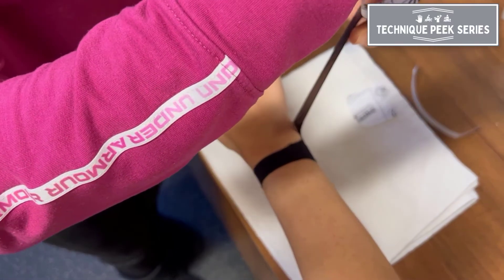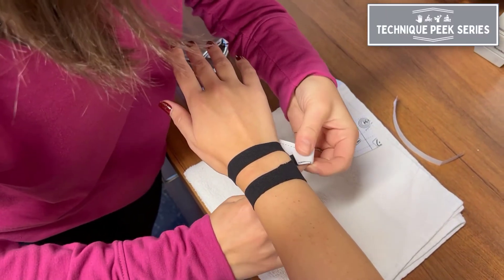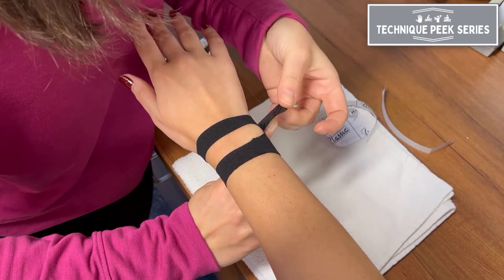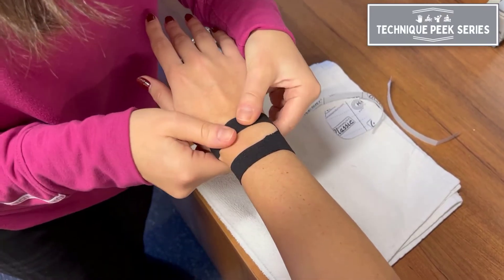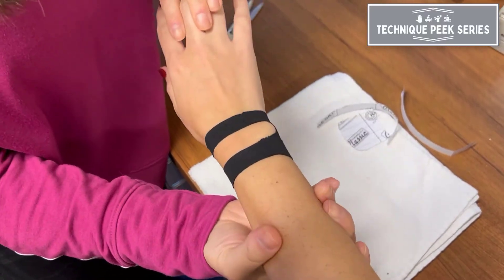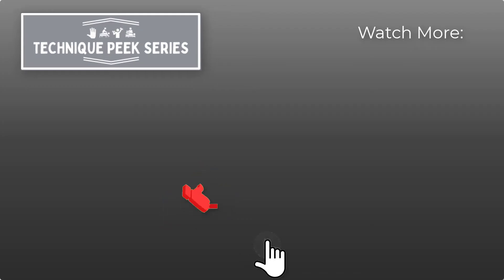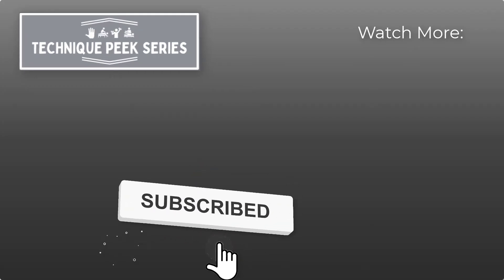This taping application provides support to a painful wrist when healing from a TFCC tear. It does not limit motion, but it promotes faster healing by reducing pain and improving weight-bearing abilities.